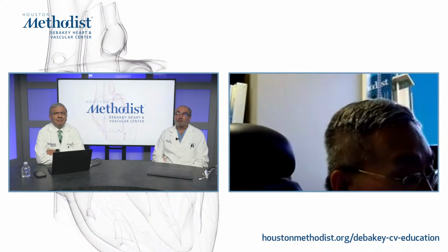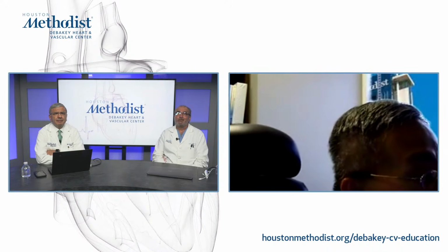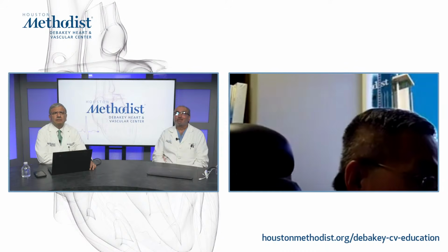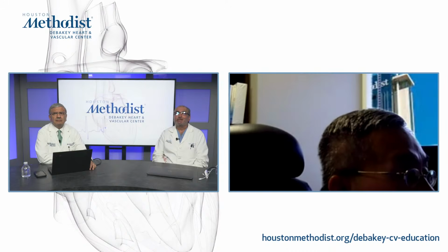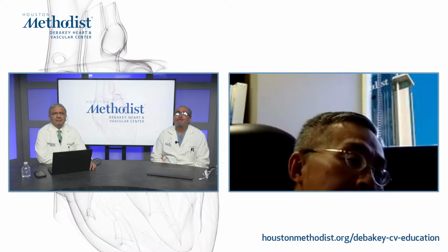The other thing that I try to show here that I think I did not spend enough time on is if the patient has a bioprosthetic valve and you plan for valve in valve, as I showed you, you don't need to have a contrast study because you can see the strut.